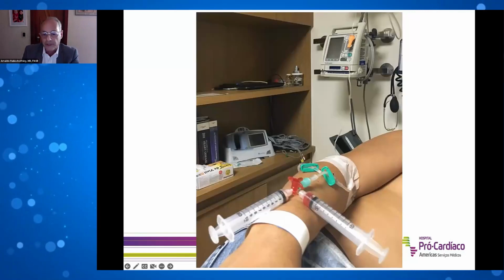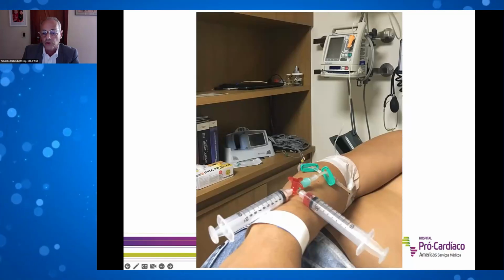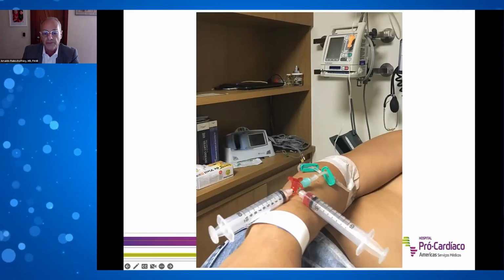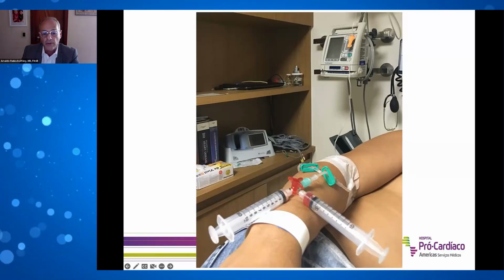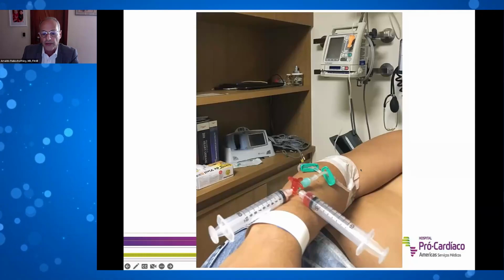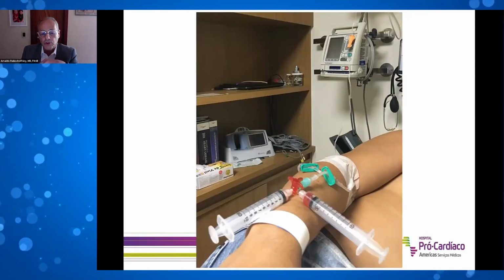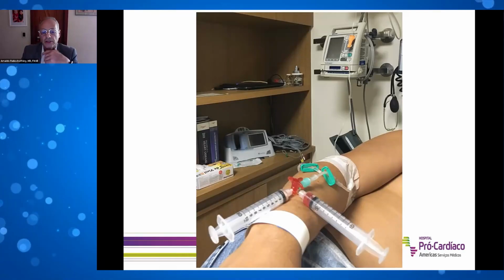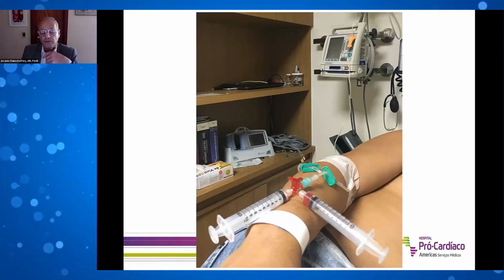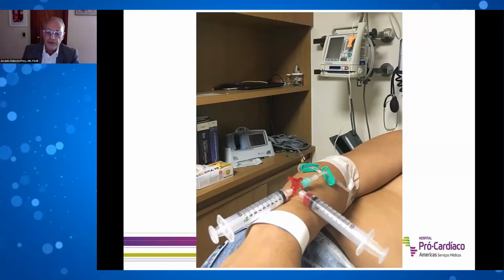In our country, either the doctor or the nurse is allowed to make the vein puncture, and we use a stopcock with the vial to introduce the contrast. We use it in bolus, with a very slow injection, and after the injection of the contrast, we use a slow infusion during 3 to 5 seconds.